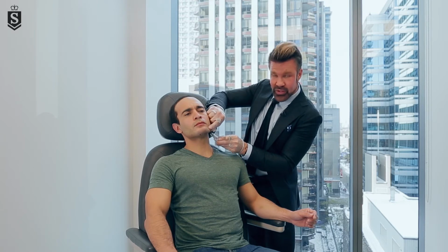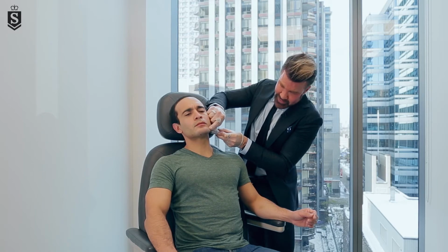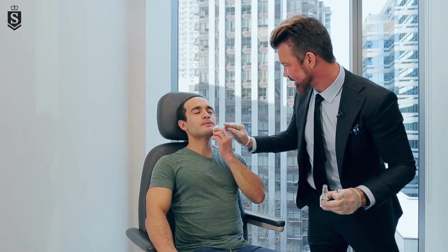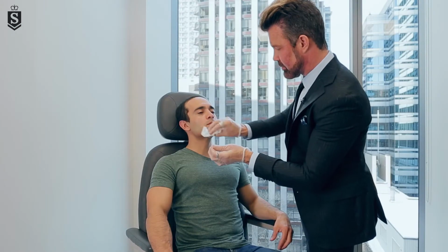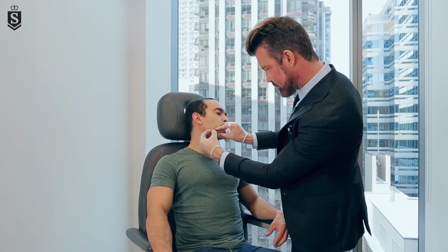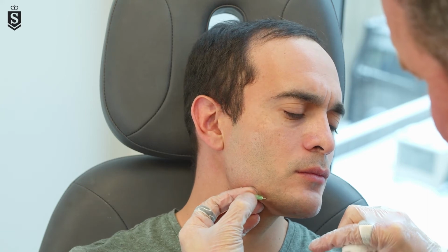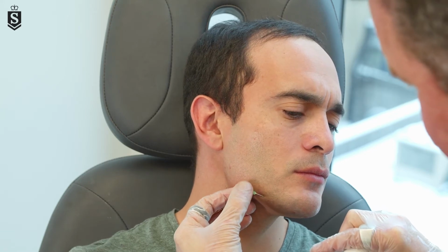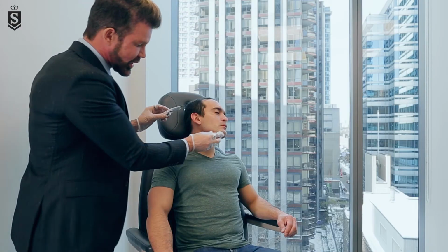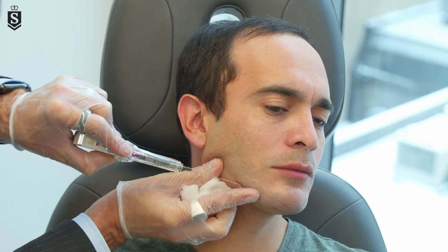Right now I'm more in a superficial fat compartment. Perfect. And just turn here slightly. I'll do the same. 1, 2, 3, boom. And again, I'm using that Ultradeep. We're gonna go through that trocar.